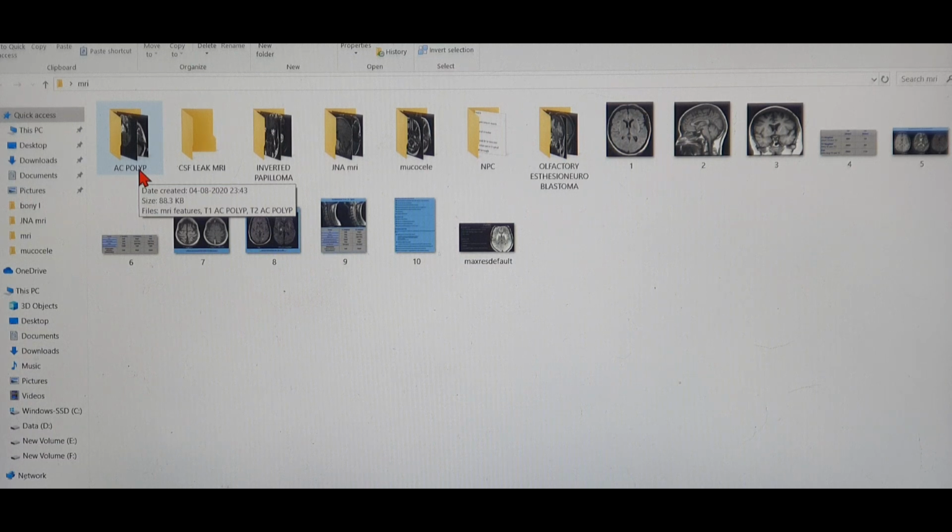So in all these conditions, how does an MRI actually help in identifying the pre-op and the basic concepts? It helps us understand more about the condition. So I'm going to talk about the very basics of MRI.